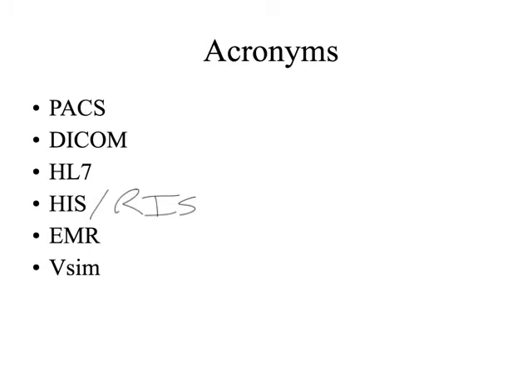vSIM, I'll use that a lot. Y'all probably have seen a vSIM, a verification SIM. Sometimes they call them virtual SIMs. I typically think of it as a verification SIM. When I think of a vSIM, I'm thinking about, okay, I did my CT scan, and that's great with the patient setup and everything. The dosimetrists did their treatment plan. They sent that over like on ARIA to the radiation therapy machine, and now during our lunch break or whenever we've got some downtime on the machine, we're going to set up the patient and take port films and make sure that everything verifies, that everything checks, right down the line. So that's a vSIM.